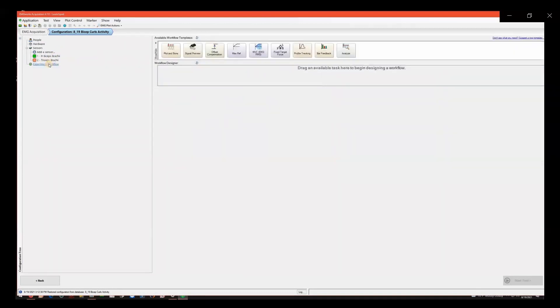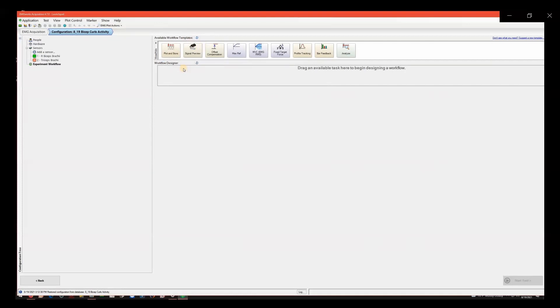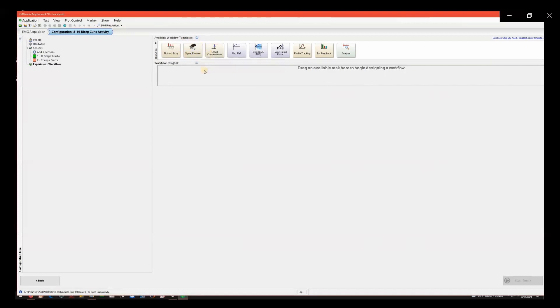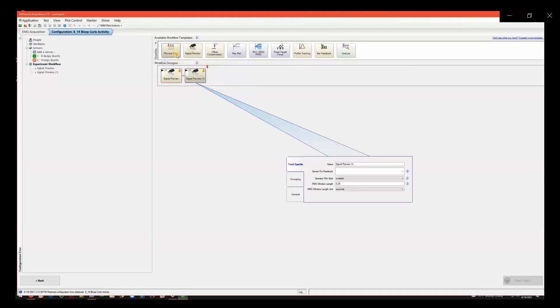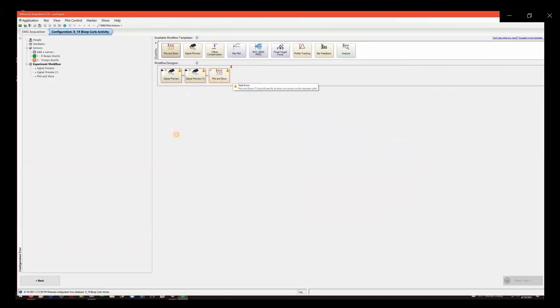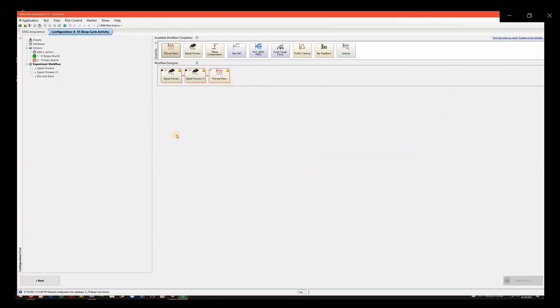Next, click on Experiment Workflow on the left side tree. The top row of boxes make up your library of workflow templates. You will manually click and drag these templates to lower sections to design a workflow for your experiment. You can hover over each of these templates to get a better understanding of its details. Signal Preview and Plot and Store are the templates you will use most often. Now, click and drag to pull them down into workflow design. To remove any unwanted templates, click and drag them off the screen and they will disappear.